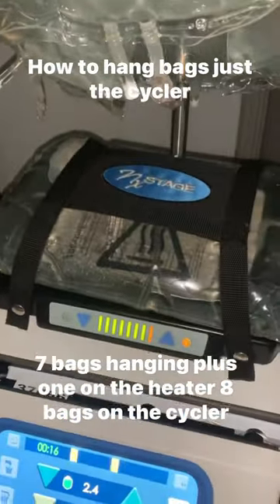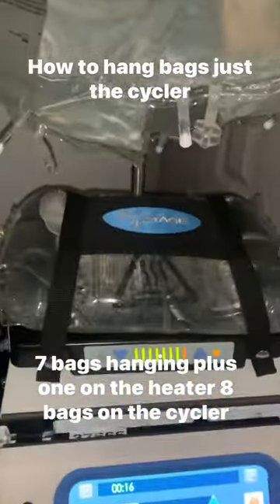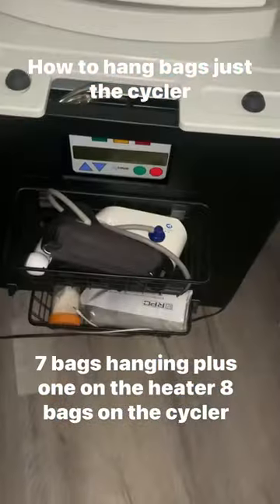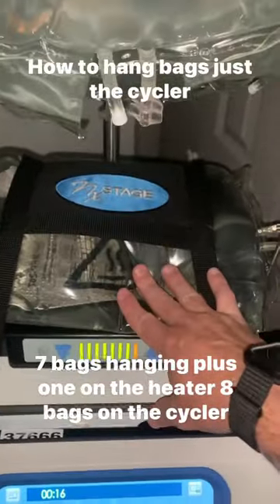Hey guys, this is Michael with Living on Dialysis. As you can see, I've got my machine heating up. I put this bag on there yesterday. The reason I'm having new bags is my Peel Pro decided to take a dump on me. So I have this one heating up from yesterday.